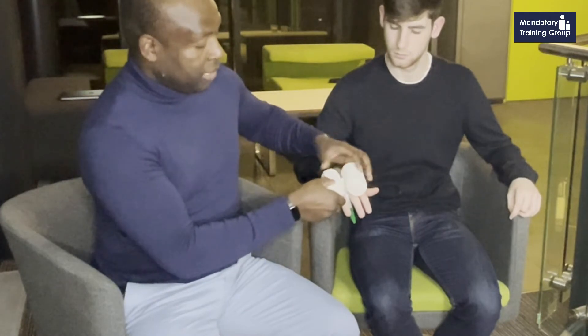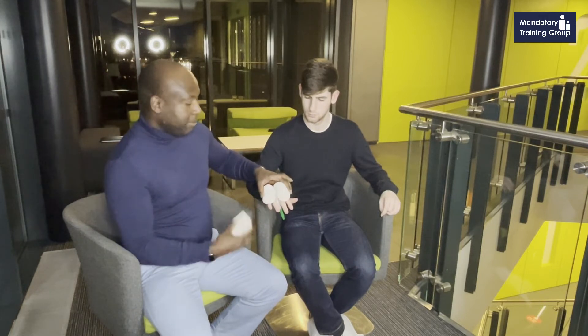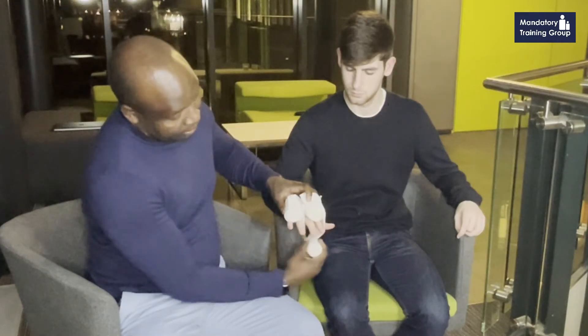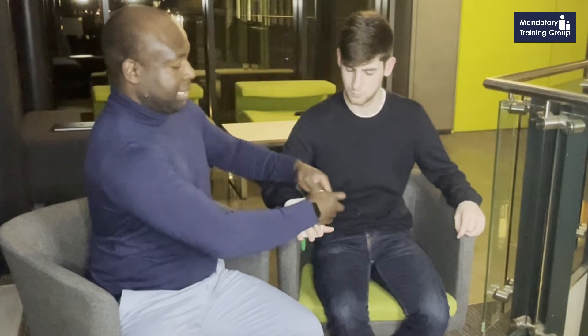It'll also be very difficult to stop the bleeding if you remove the object. I'm going to use these two bandages to secure the object so that, once I've secured it and it's sitting intact, I can then bandage around it. In this case, I'm just going to put a bandage around the object and the fingers to get the first part done.